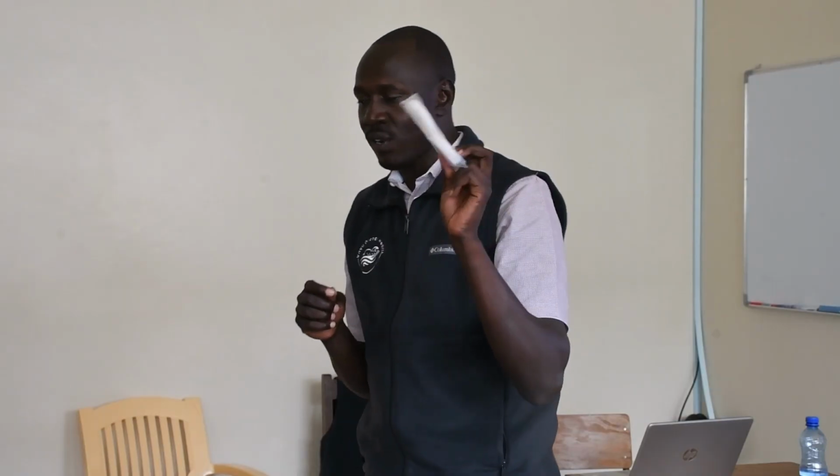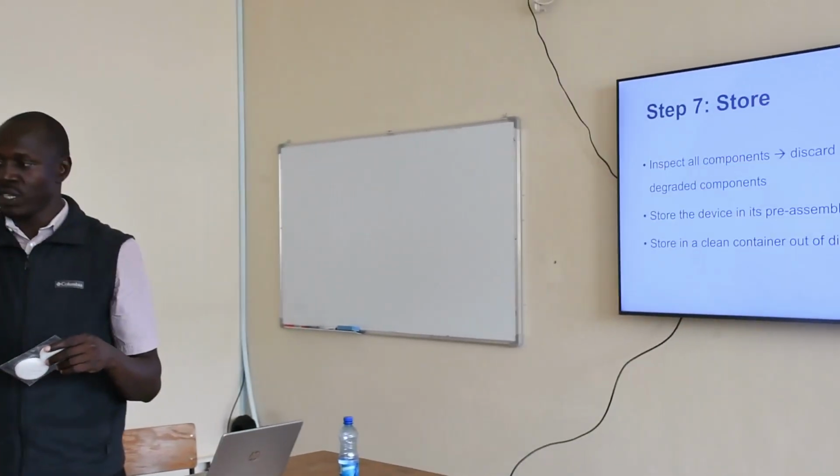So she's asking, where will you get the filters for replacement? I think a very important question. If filters finish, where are you going to get the filters? So you can buy filters. You can buy from a distributor. We have a distributor in Kenya.